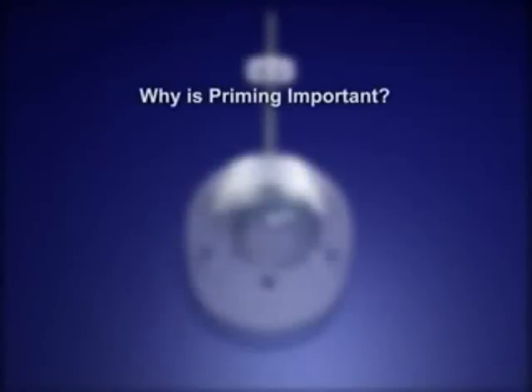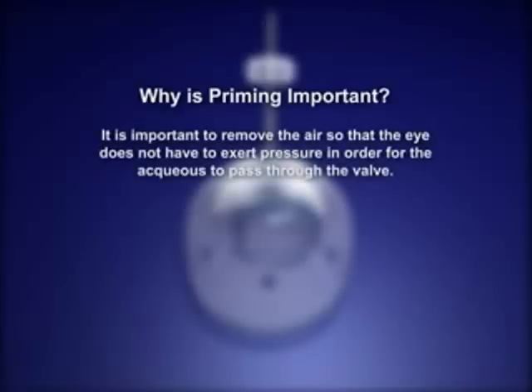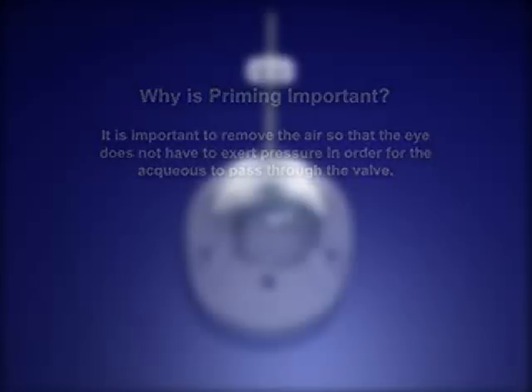Why is priming important? It is important to remove the air so that the eye does not have to exert pressure in order for the aqueous to pass through the valve.